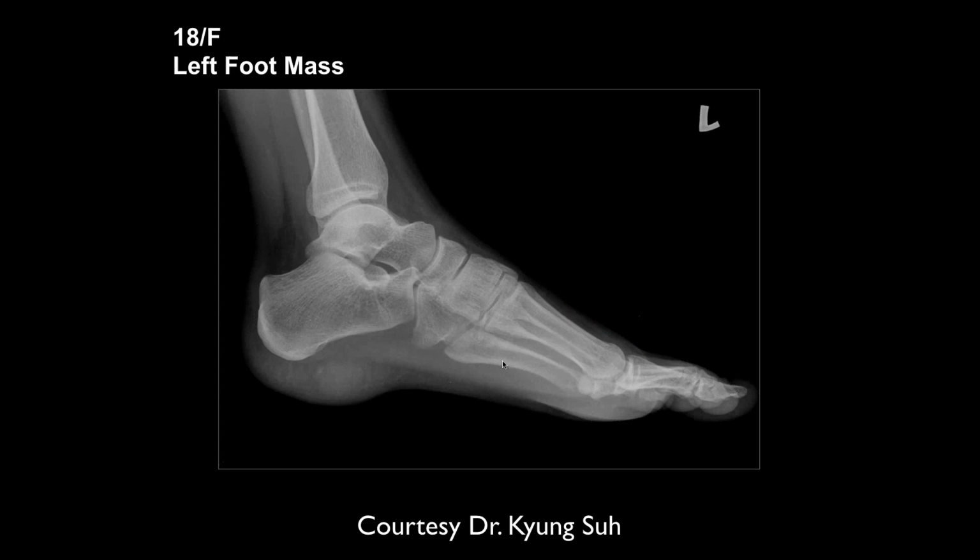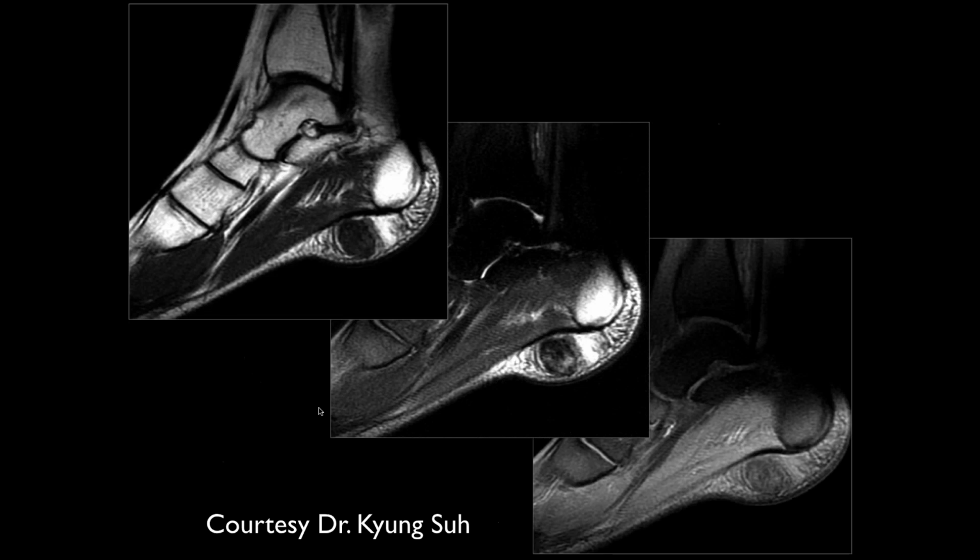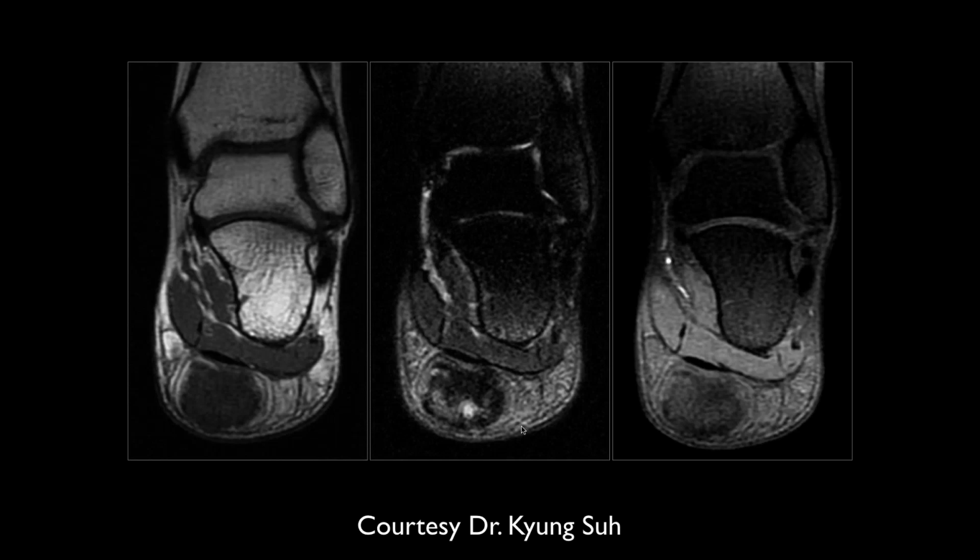So here's a lateral radiograph of an 18-year-old female with a left foot mass, and along the plantar aspect of the heel, we're seeing this increased density there, maybe even a little calc or something in it. Here we are in MR, and it looks like we've got sagittal T1, PDFS, and probably T1FS post-contrast. And we're seeing this oval-shaped hypo-intense lesion with a couple foci of hyper-intense signal. It's got mostly pretty good margins, although we've got a little bit of maybe spiculation along the lateral thing there.